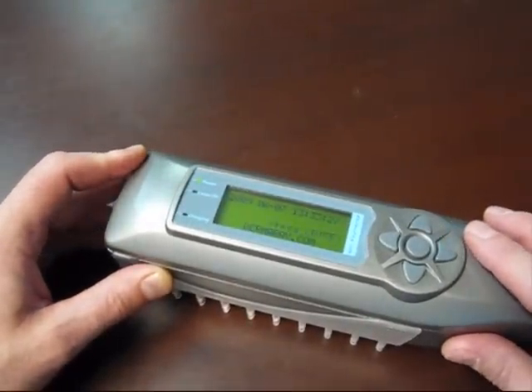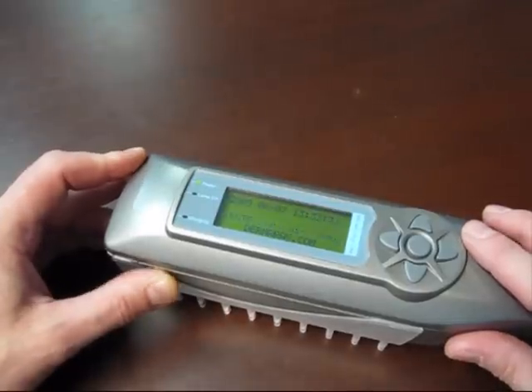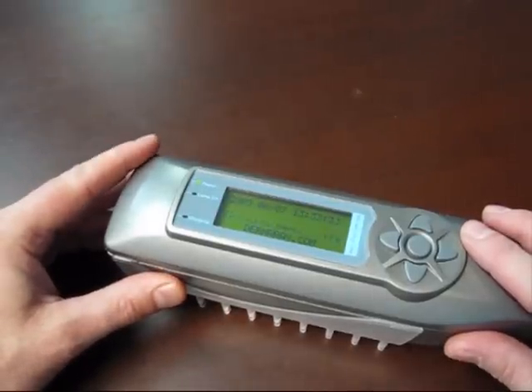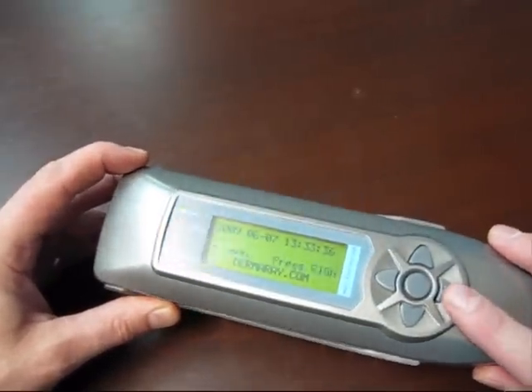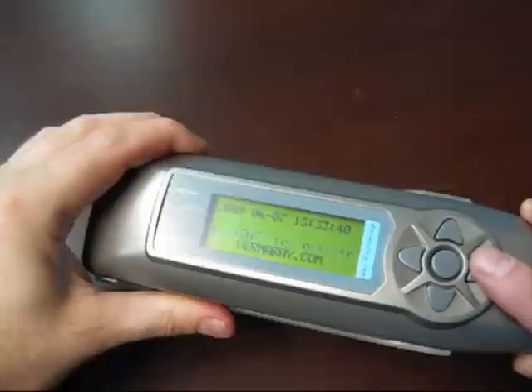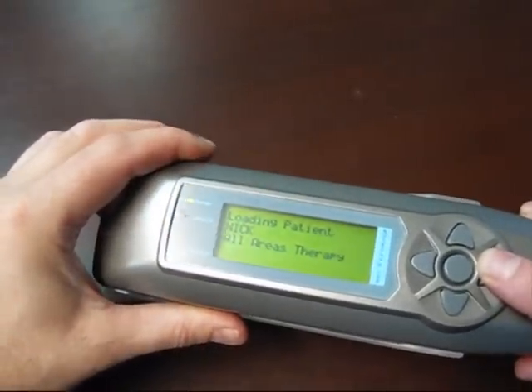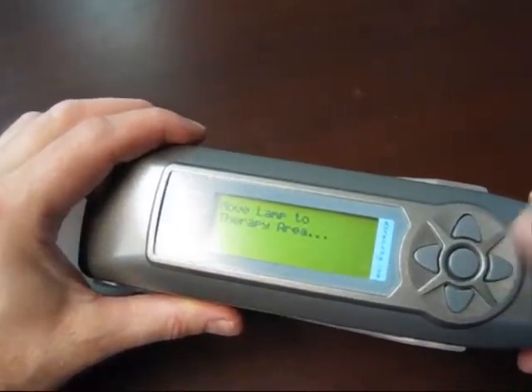To load the treatment for the last patient who used the system, or the only patient if you've just run the setup wizard, simply hold down the right key when you're at the welcome screen that says dermaray.com, and it'll load the next treatment automatically without having to go into the menu. So it's loading patient Nick, all treatment areas.